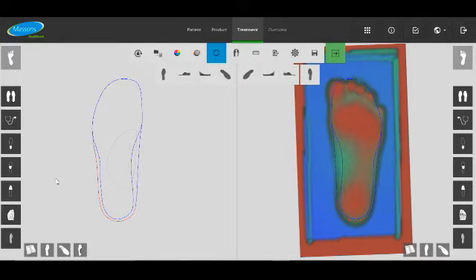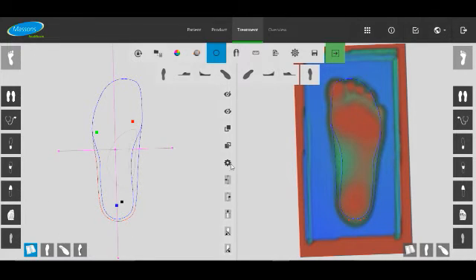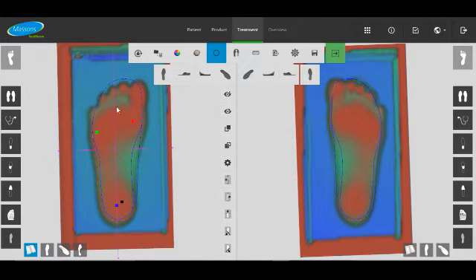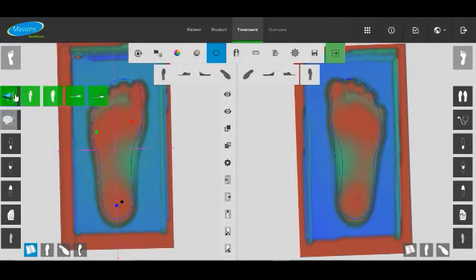Alright, this design is going to be done over a foam box scan, done on the laser foam box scanner. The alignment looks pretty good. The dots are under the 1st, 5th and under the heel.